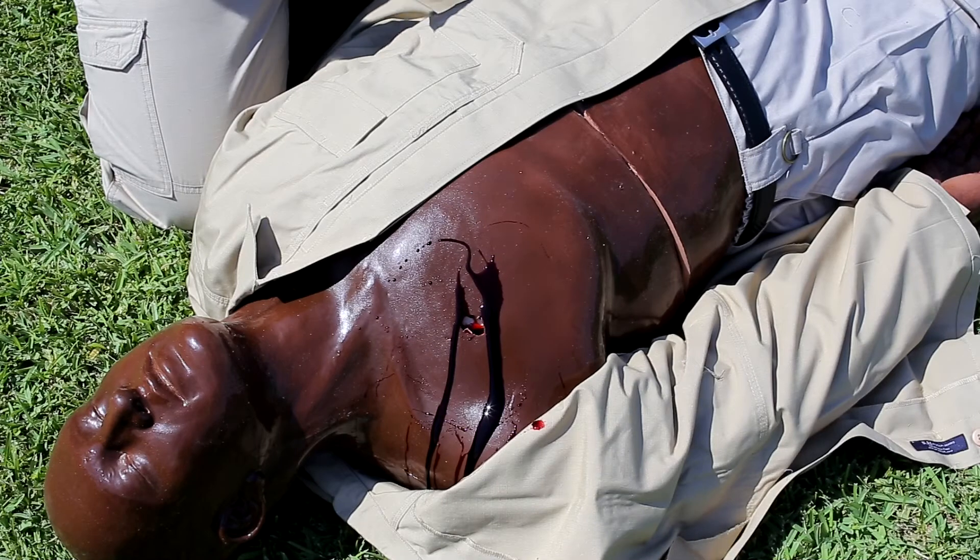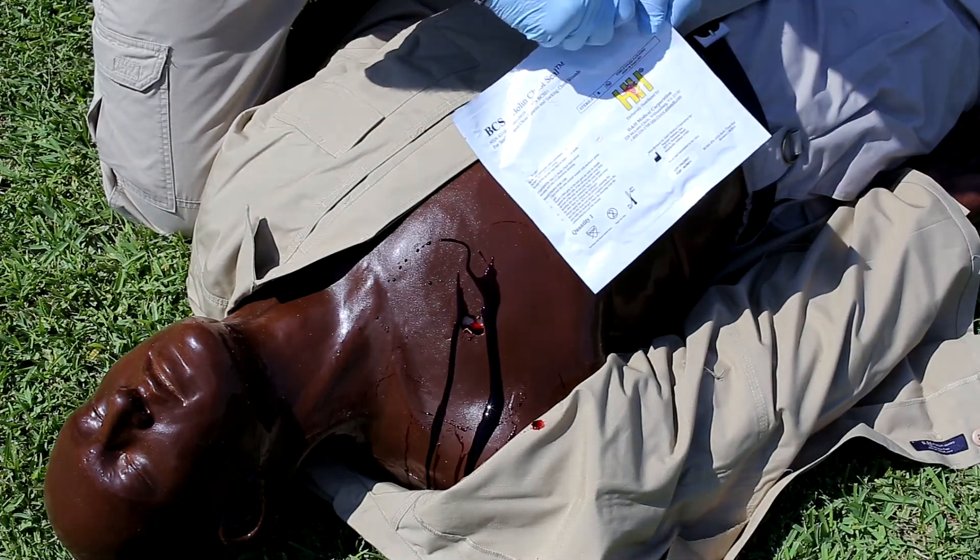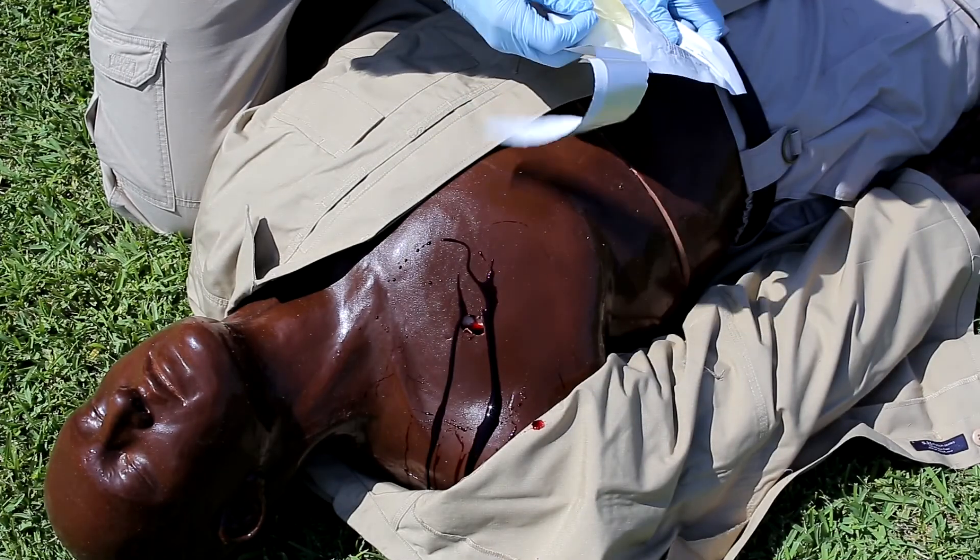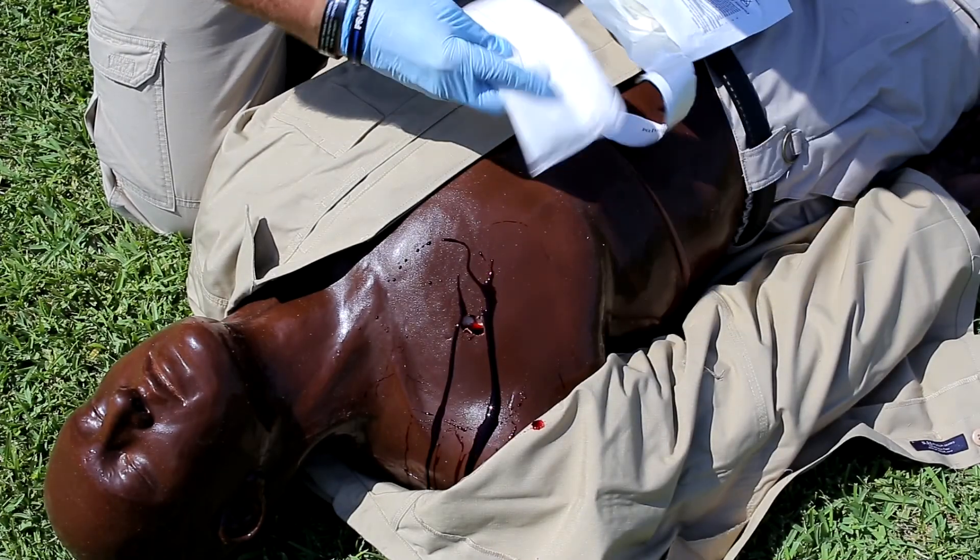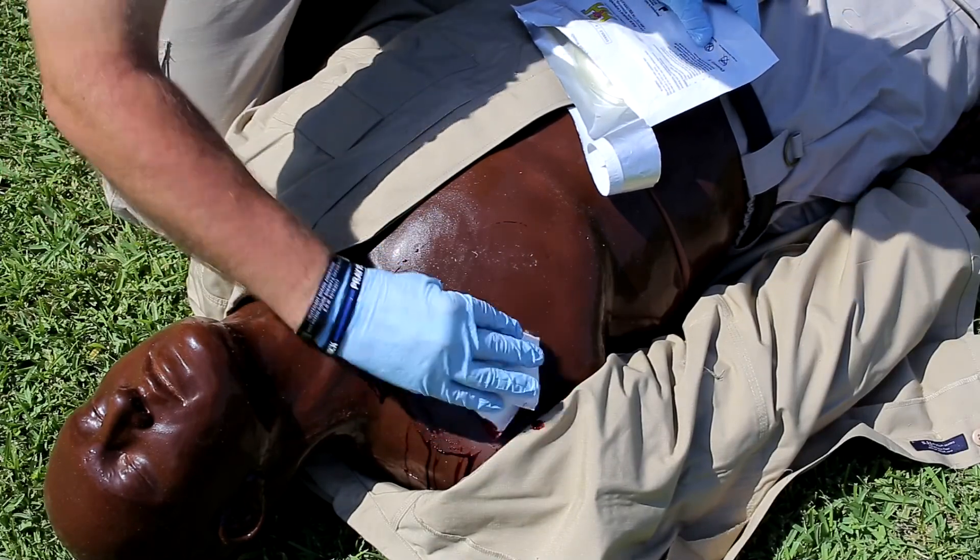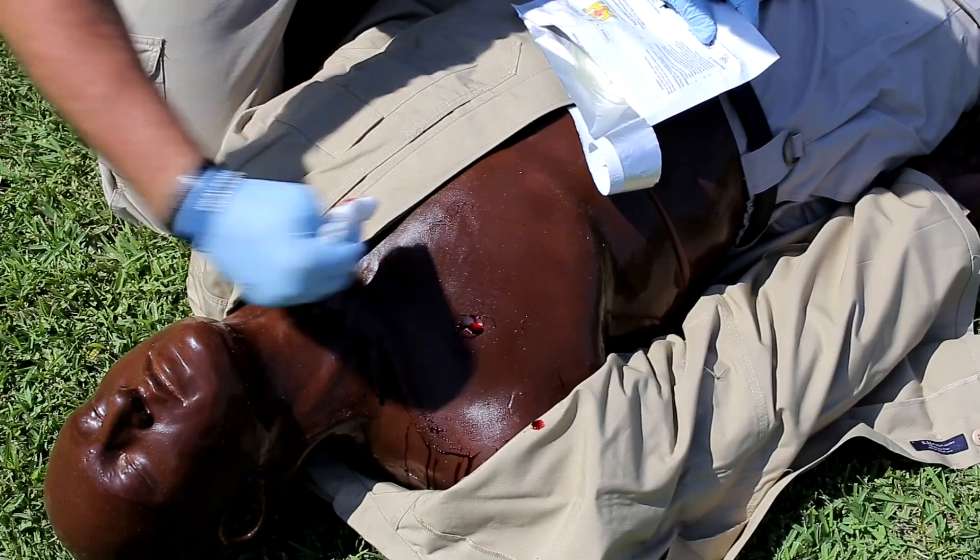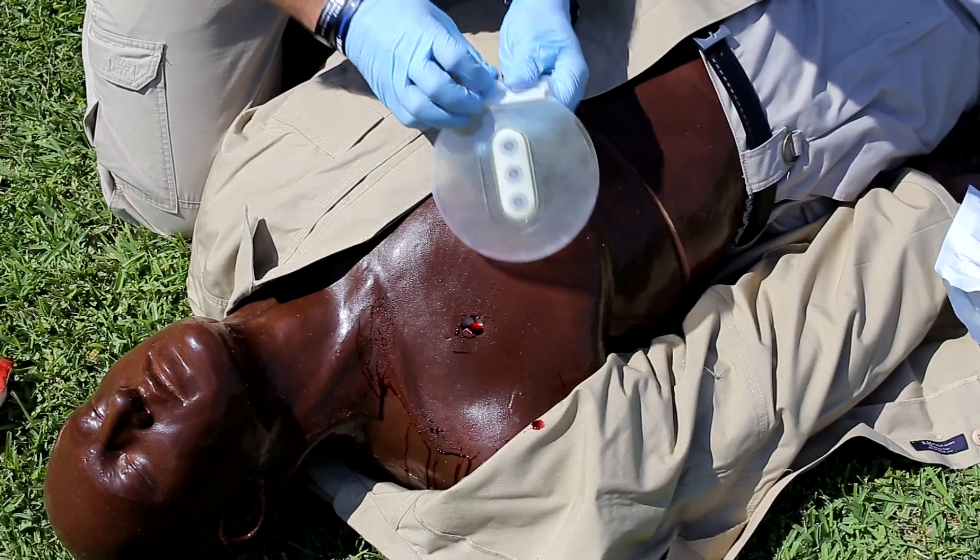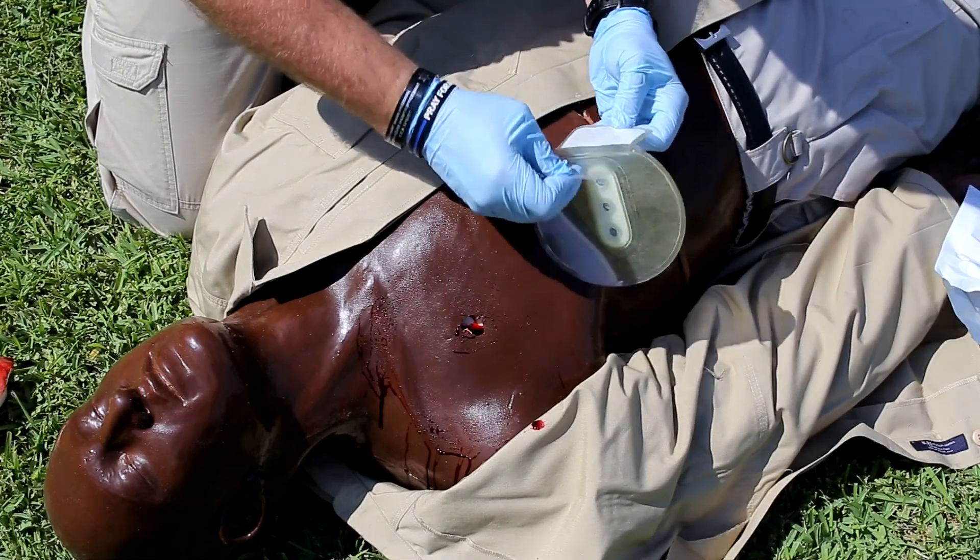Expose the patient's torso and locate the chest defect. Using the included gauze, clean the wound site thoroughly and immediately apply the Bolin chest seal, centering the valves over the wound. The BCS will best adhere to a clean, dry surface, so proper preparation of the wound site is critical to establishing the best possible seal. Fully inspect the remainder of the patient's torso to locate any additional wounds.